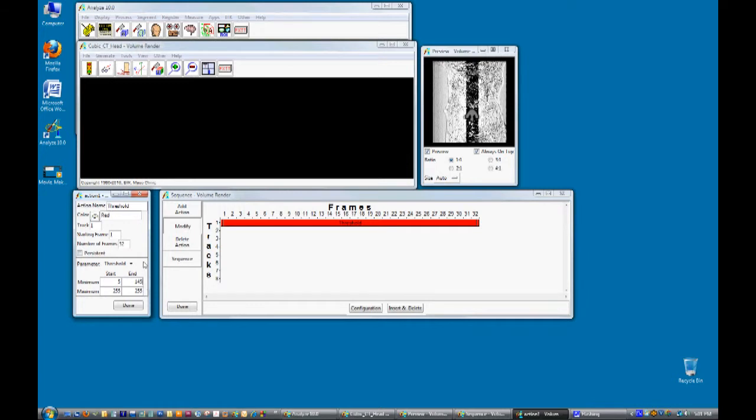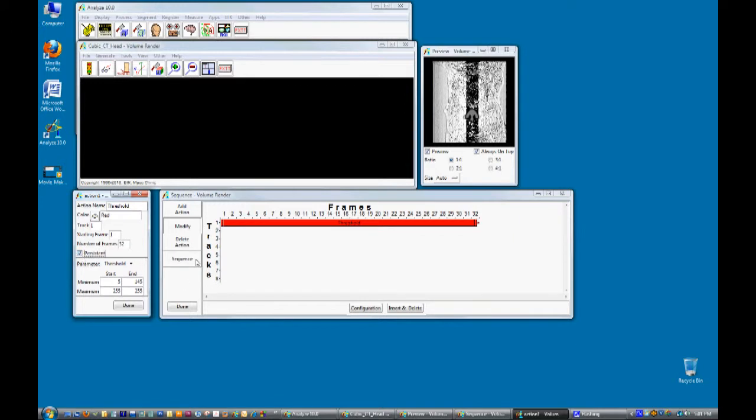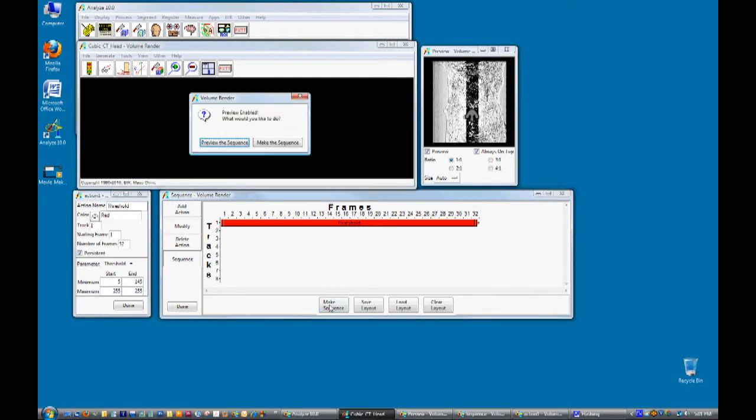Because we will add additional actions after this action, check the persistent option. To preview the movie so far click on sequence and then make sequence, and then check on the preview sequence option.